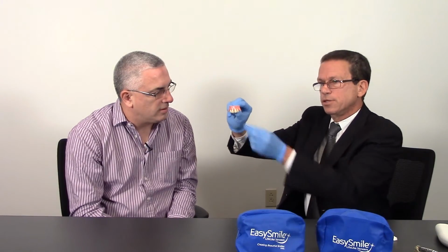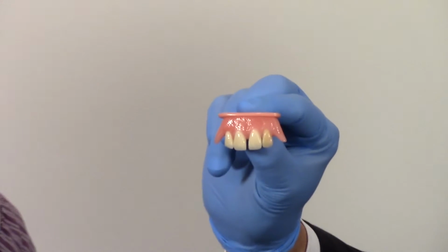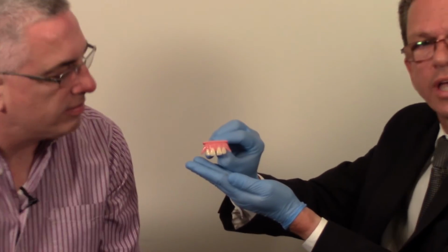And I already have an example of a typodont with a case like that, where you can see the discolored tooth over there, the lateral incisor. And I made a veneer, which again, let me show you, is incredibly translucent. Let's see the finger, the glove, very thin. Yet, even though it's translucent, somehow it's able to mask out the discolored tooth, which you'll see when you put this on top of the tooth. You can't see the discolored tooth.